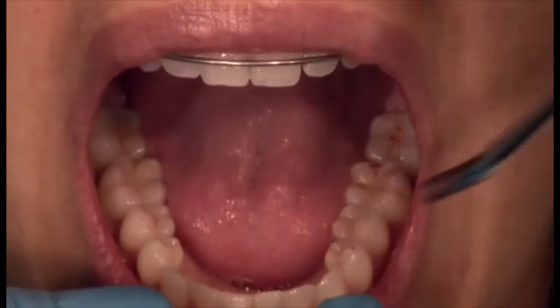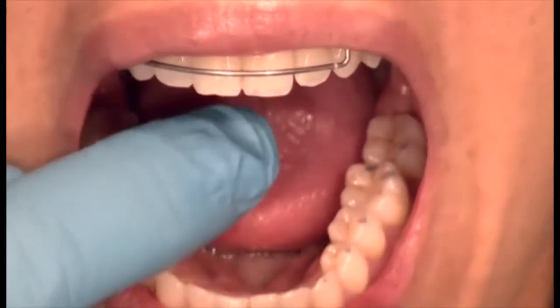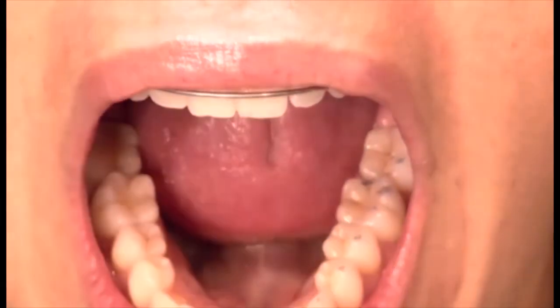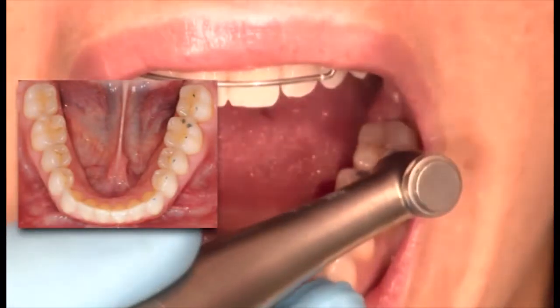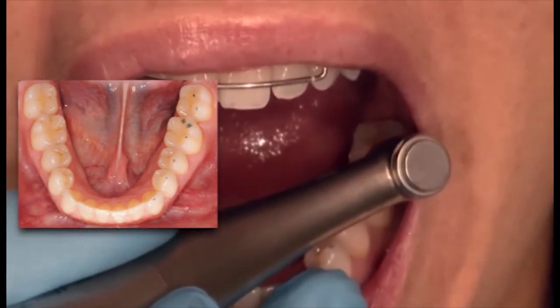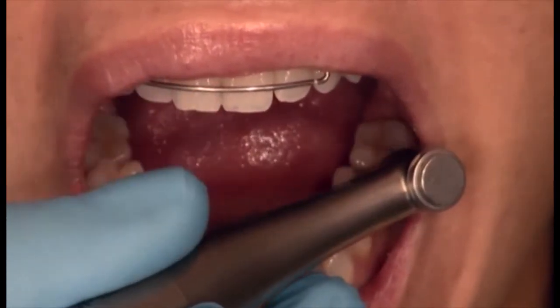Open. This is the blue articulating paper. The red one is Accufilm. Tap up and down. Open. We're starting to get our marks. So as I'm adjusting, I go ahead and adjust the marks. And so remember, where I'm adjusting the marks is where she pointed. I'm taking away from those central fossas.